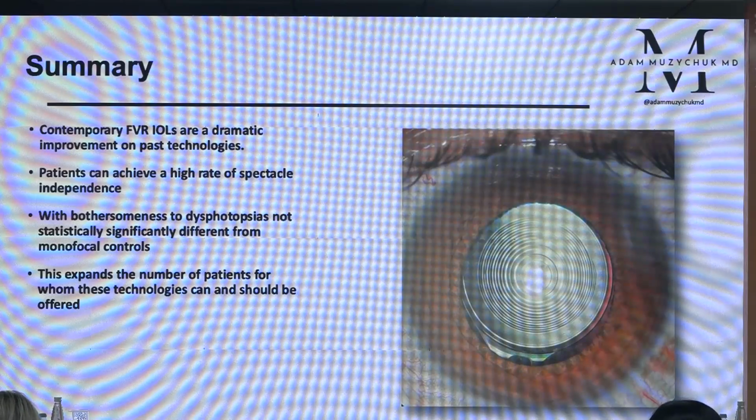This expands the number of patients for whom these technologies can and should be offered. I think we're doing our patients a disservice if we're not using them now. And if you were scared away from full visual range IOLs in the past like I was, now's the time to come back. Thank you.